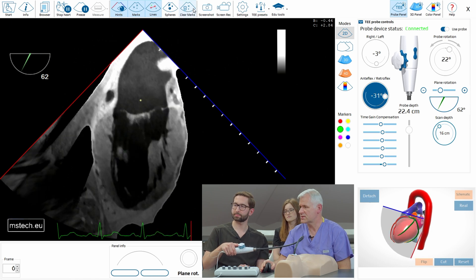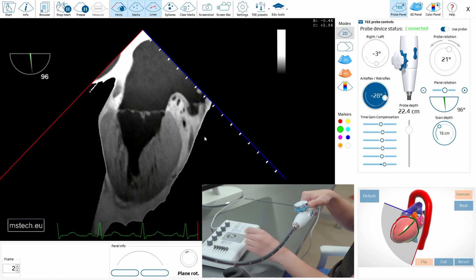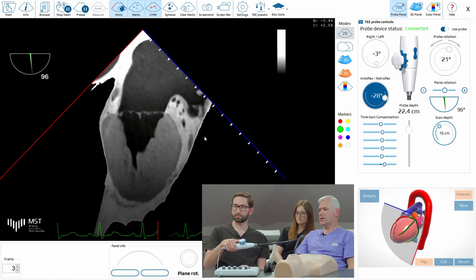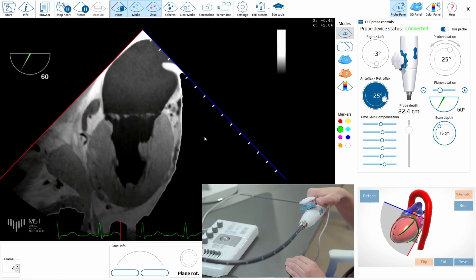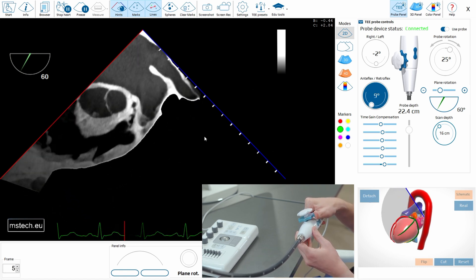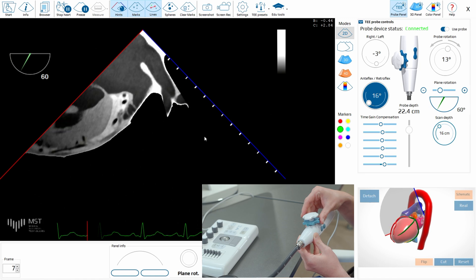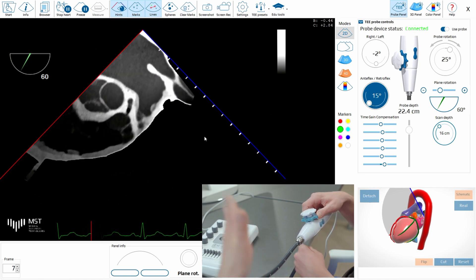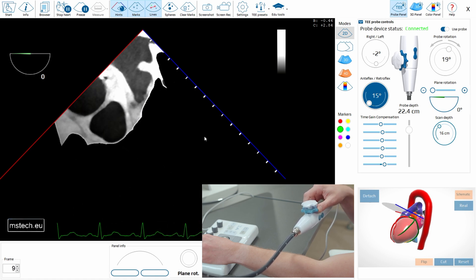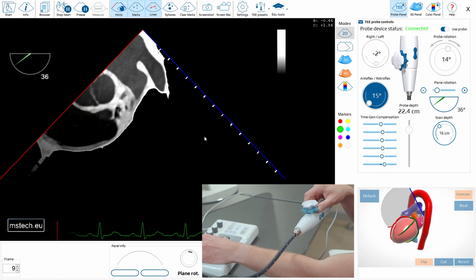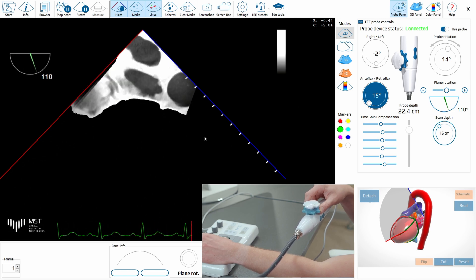For this very first approach it's a really very good result. Now let's go to 90 degrees — I will explain later what it is used for. Come back to 60 degrees and let's go to left atrial appendage. Very good — get rid of this Coumadin ridge here. Very nice. Now you can use the angle from zero, keeping the appendage in view and then rotate.